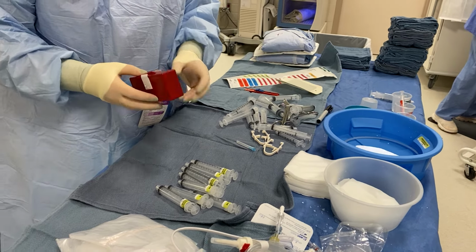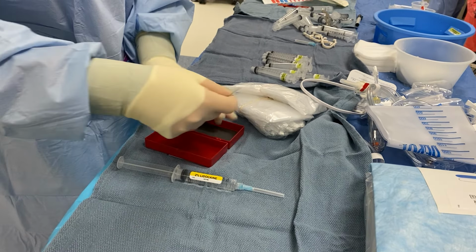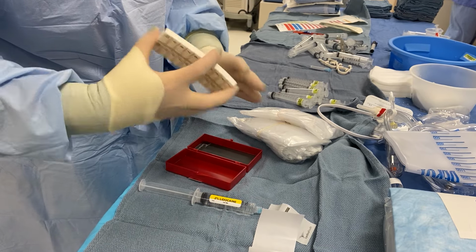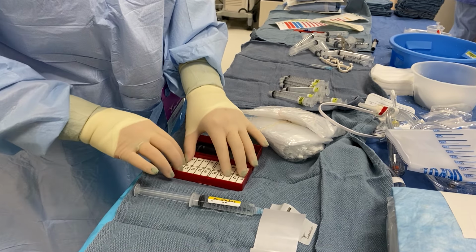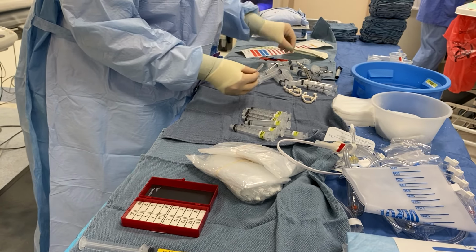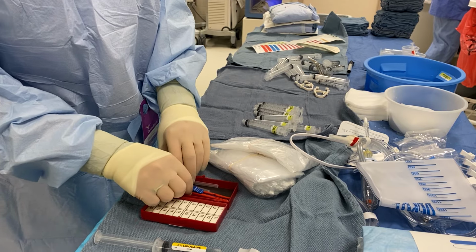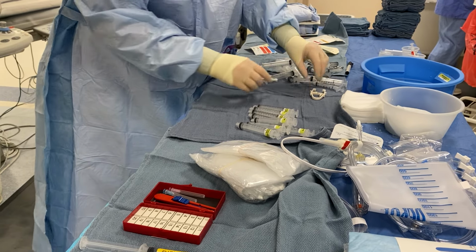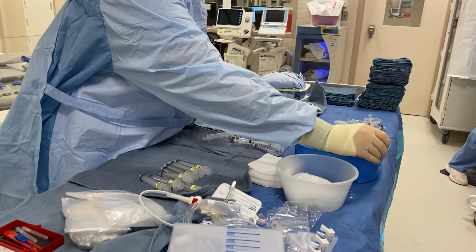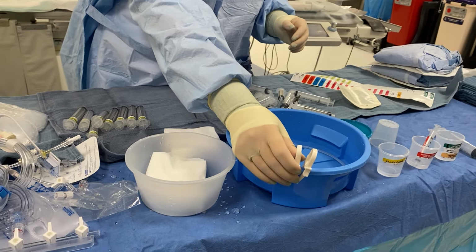And then the remainder of these things, this is our sharps box, so I'm just gonna open this up and expose the adhesive on the back side. Stick it right in there and gather any of my other sharps that I have in my pack and put them all in here so they can all be contained to the same place. Your pack may come with clips. This one does. I usually like to just stick them right on the bowl so that I always know where they are and they're easily accessible.